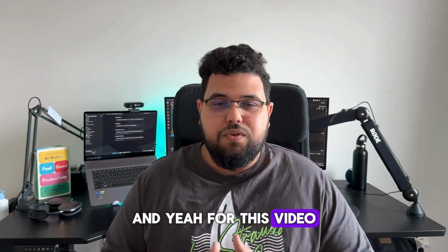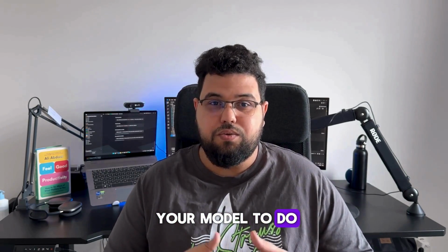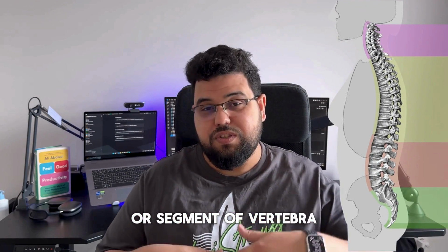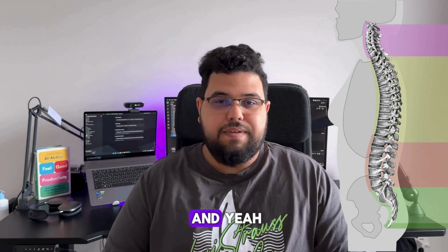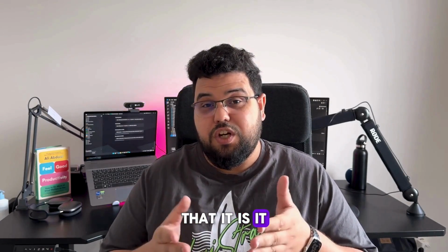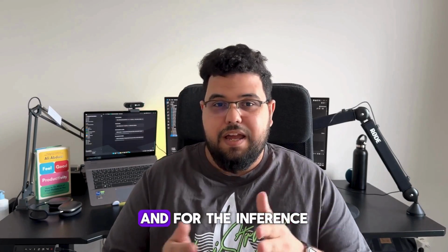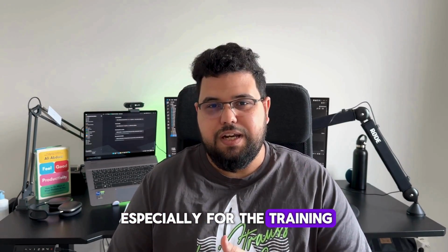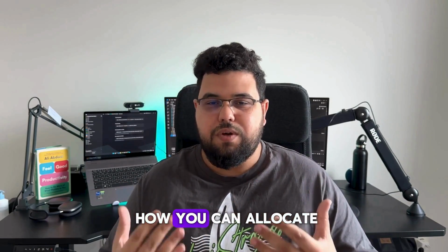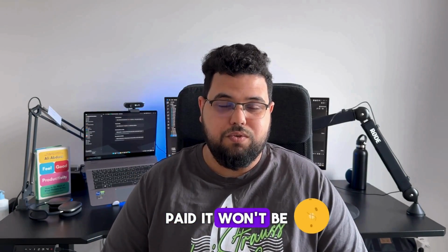And for this video, I wanted to show you how you can train your model to do image segmentation. Our task will be spine segmentation, so we will segment the vertebra. The only thing you need to know about nnUNet is that it requires high computational resources for the training and for the inference, especially for the training if you have a large data set. In this video I will show you how you can allocate a server to do that. For sure the server will be paid, it won't be for free.